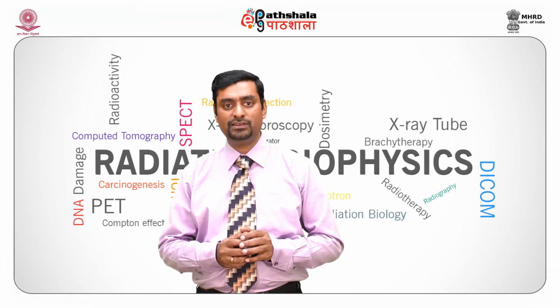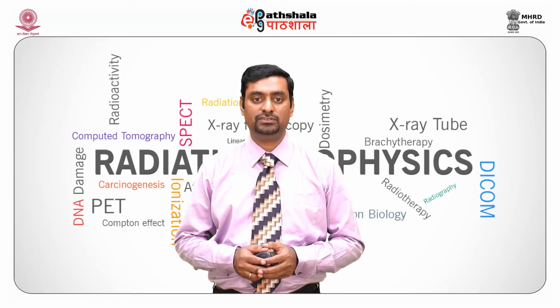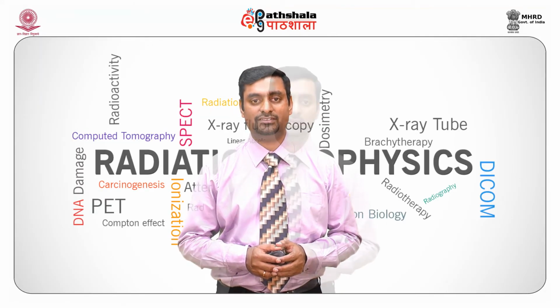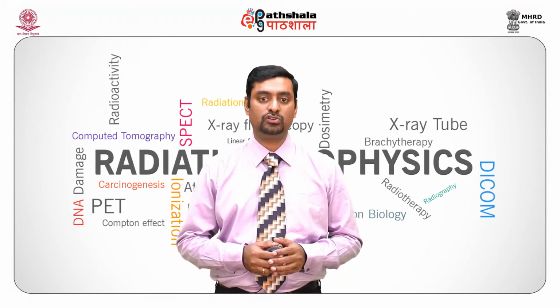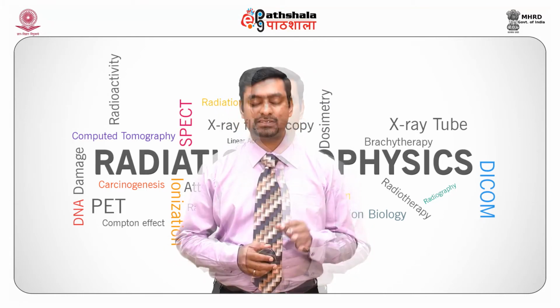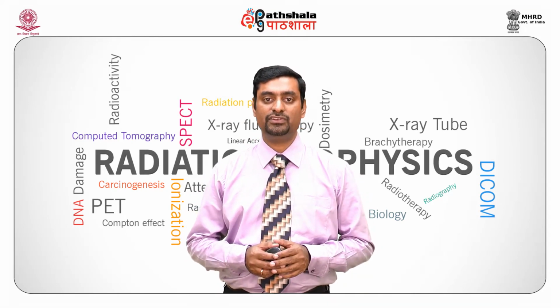The optical coupling is similar to what we see on a lens, which is used for our cameras. It consists of a lens assembly to couple the video camera to the output of the image intensifier. The lenses focus the incoming light from the output phosphor onto a focal plane of the camera. There is a small aperture in the lens assembly which varies the proportion of light entering the video camera.